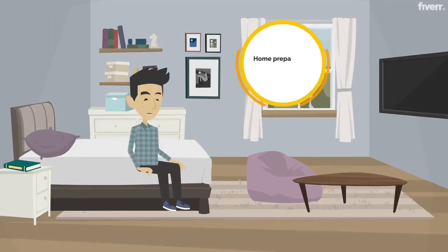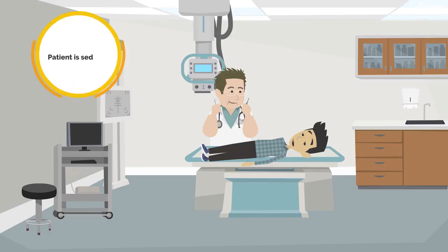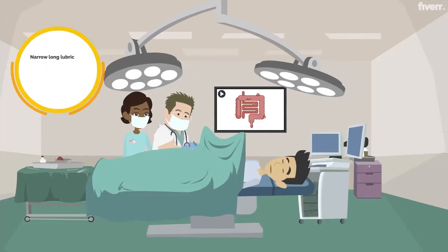The procedure. 1. Home preparations prescribed by doctor a day before the procedure. 2. Patient is sedated. 3. A narrow, long, lubricated, flexible tube with a small light and digital camera is inserted through the rectum into the large intestine.